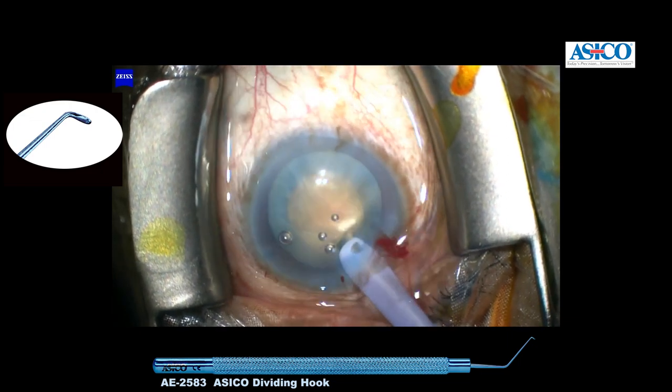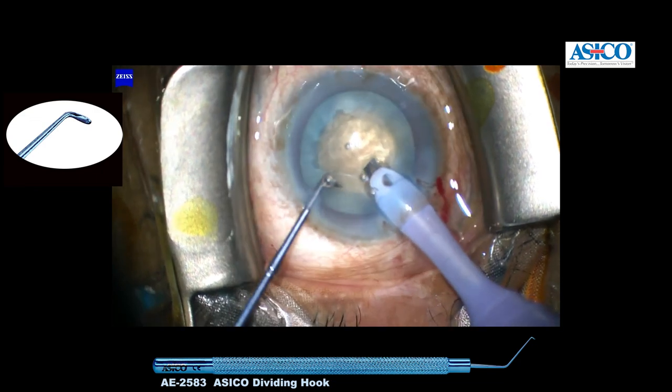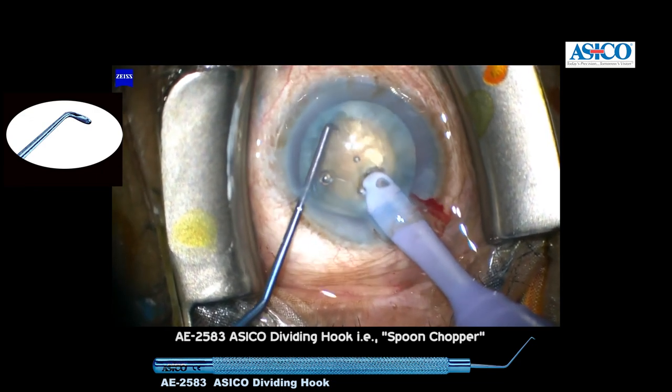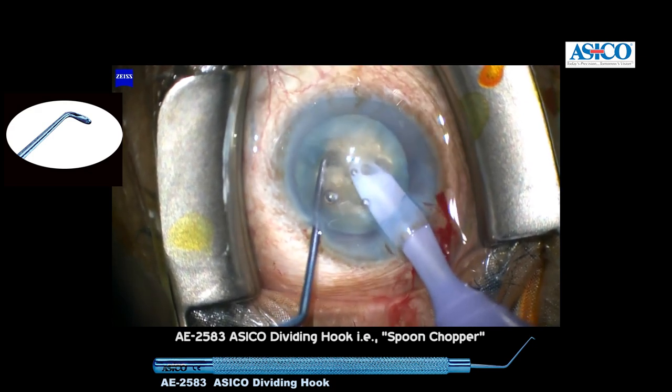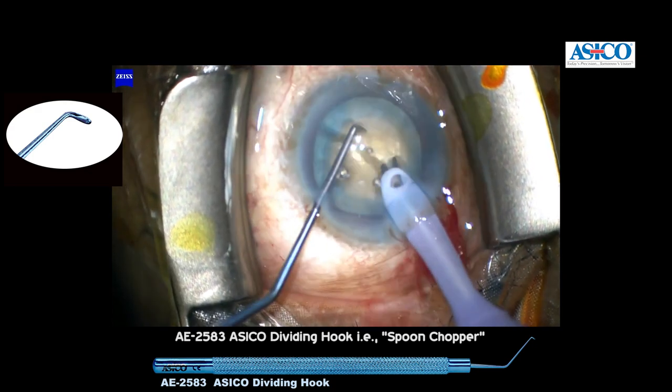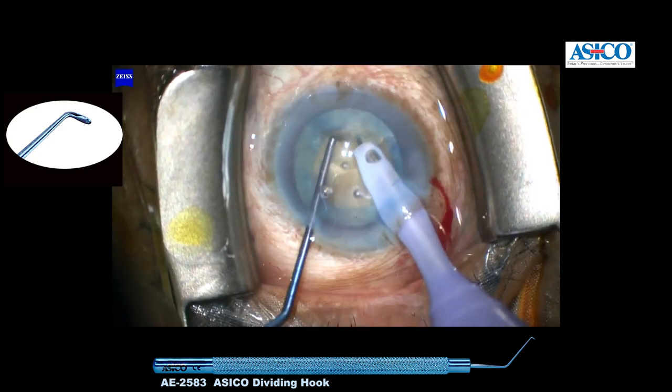This is a study done on a mature cataract, which is fairly hard. With a new spoon chopper, you will find that the chopper is economically and beautifully designed, and that the chopping edge is towards the phaco tip.